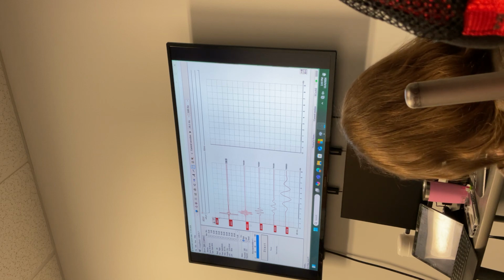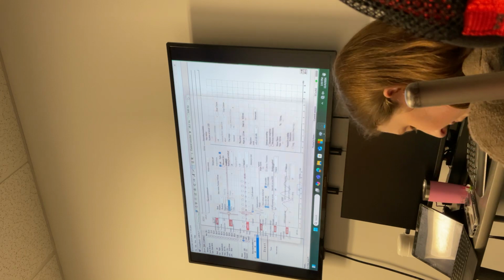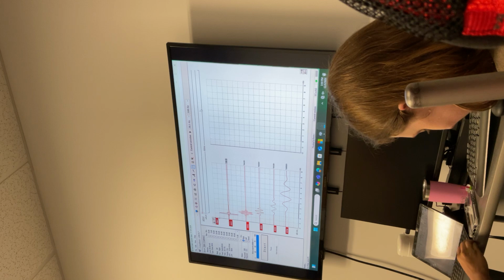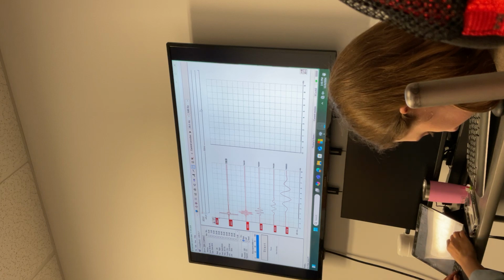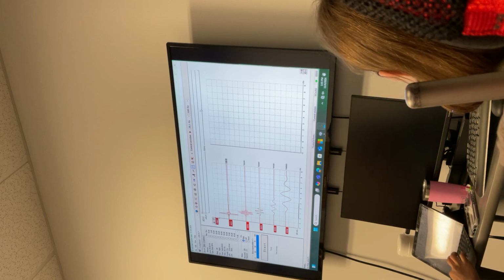So again, this is 4,000 Hertz rarefaction. Let's see. When you say visualize, do you mean like how it's traveling? Yeah, the sound energy, like sound travels through condensation, rarefaction, high pressure, low pressure.